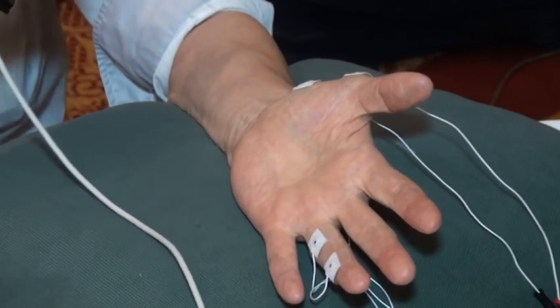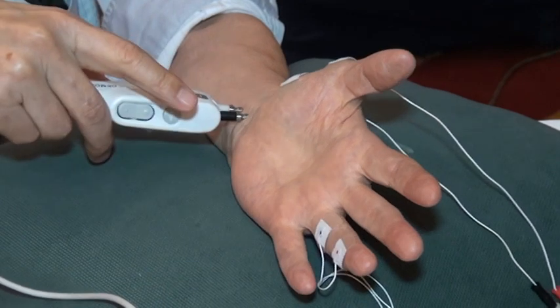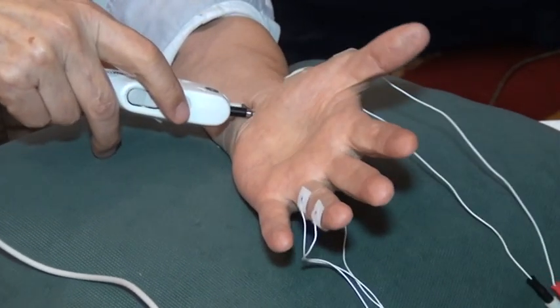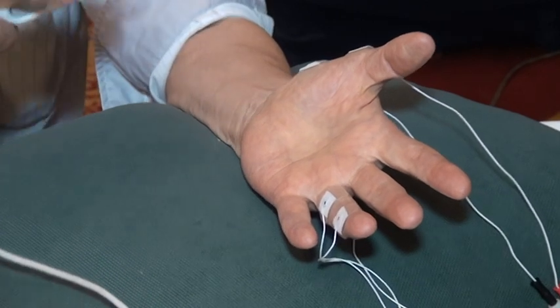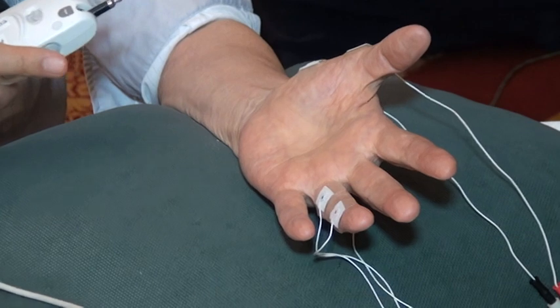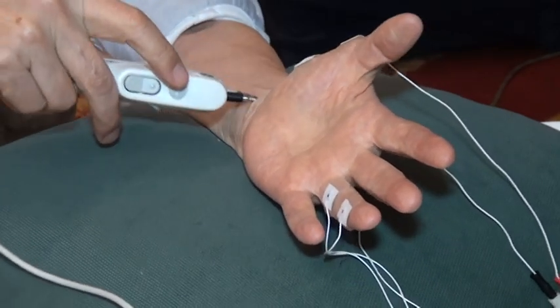We are using Nihon Kohden equipment, which came from Dubai with my friend Alejandro. And we had great difficulty this noon controlling the interference pattern. Hotel rooms are notoriously bad because they are not grounded properly. And somehow we have figured it out a little better.